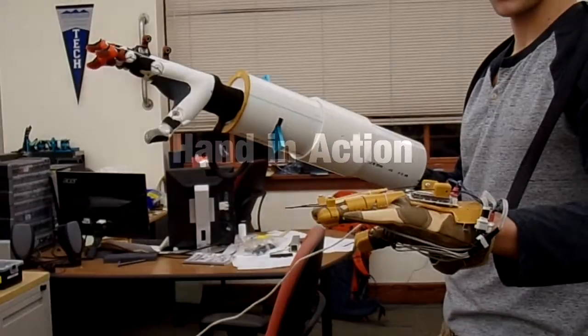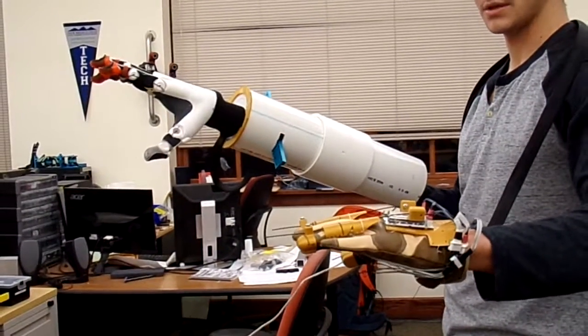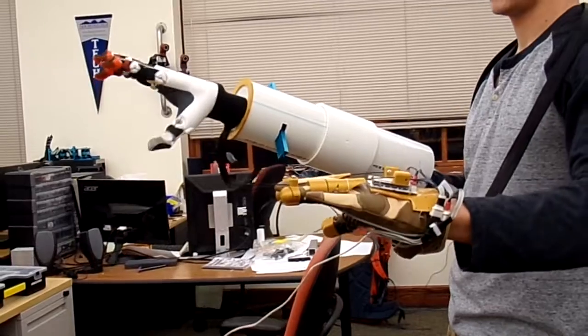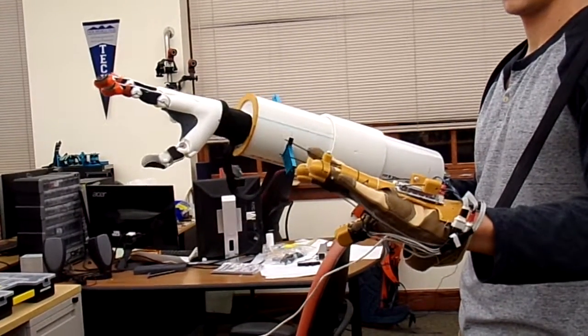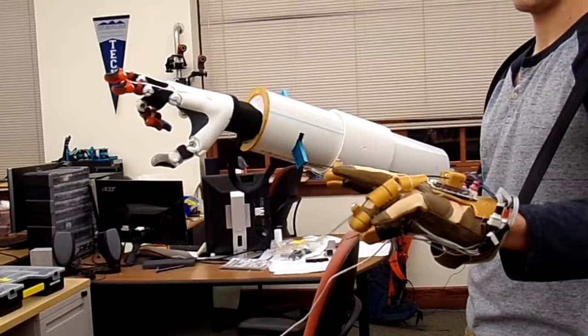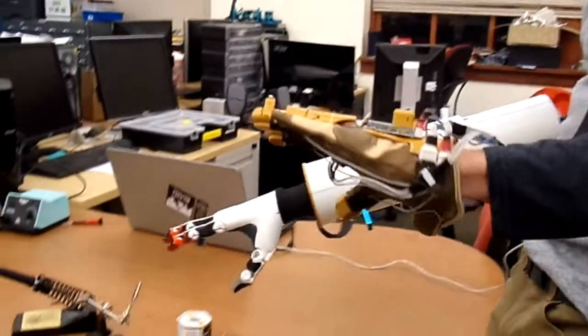Okay, so this is now just a demo of our hand actually working and put together. You can see that as I rotate my contralateral hand, the wrist rotates accordingly. Additionally, I have full control over individual thumb, and then index and middle finger movement, as well as ring and pinky finger movement. So let's see if I can pick up any objects.